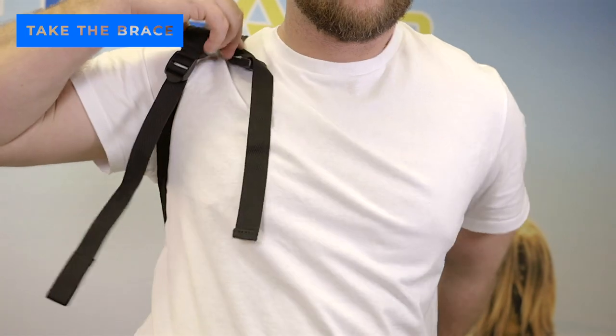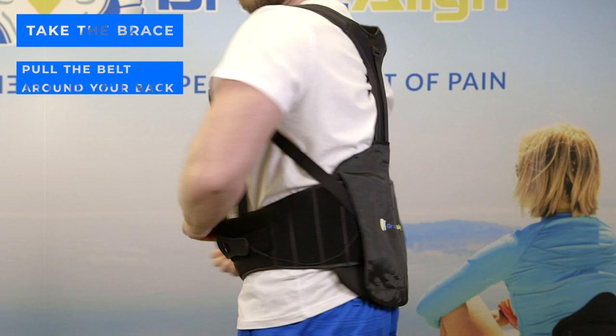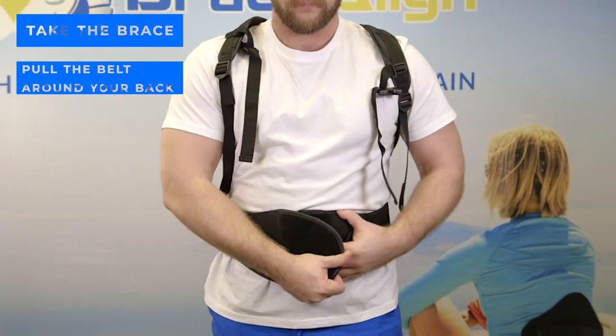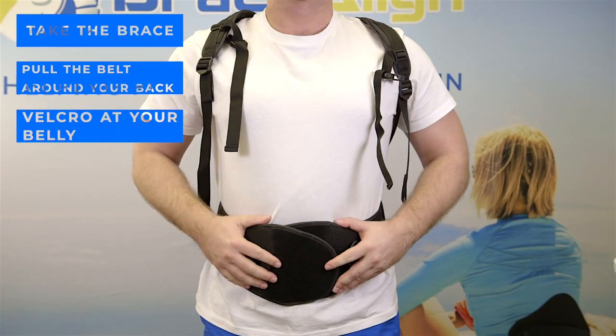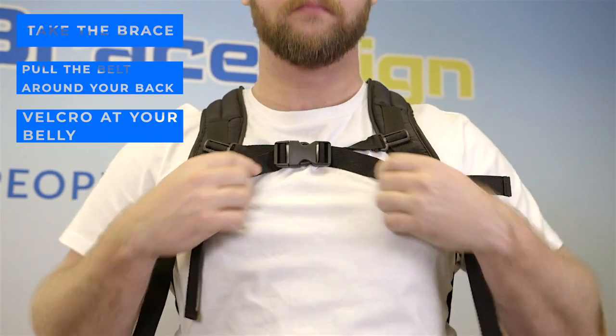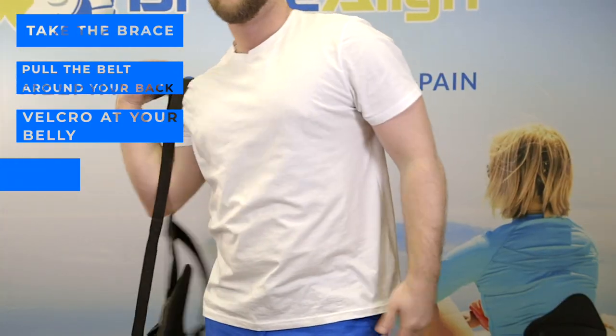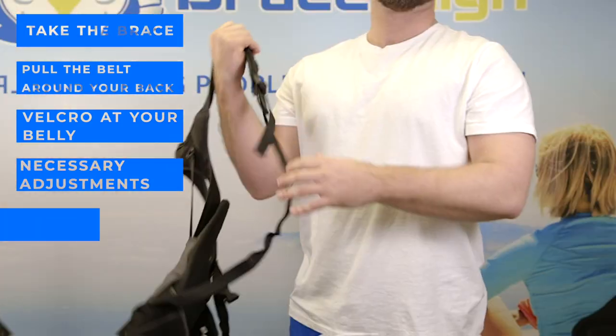Take the brace and apply as if you were putting a backpack on. Pull the belt around your back with the back panels just on the tip of your buttocks. The front of the brace should line up and velcro at your belly. The top of the brace should fit just below the prominent notch of your neck. If the front or the top of the brace does not line up, remove and make necessary adjustments and reapply.